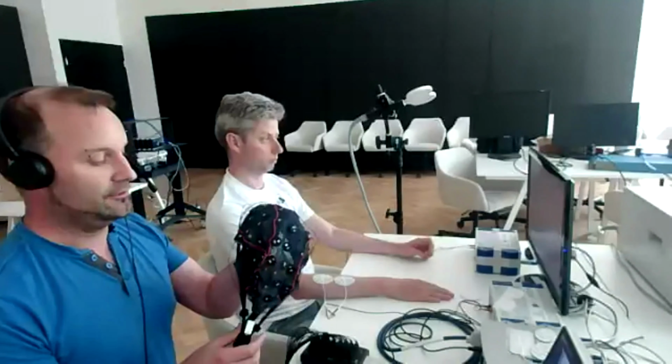For those ones, you have to take care a bit, because as they are so flat, there is not really so much space there. And you don't need a lot of gel.